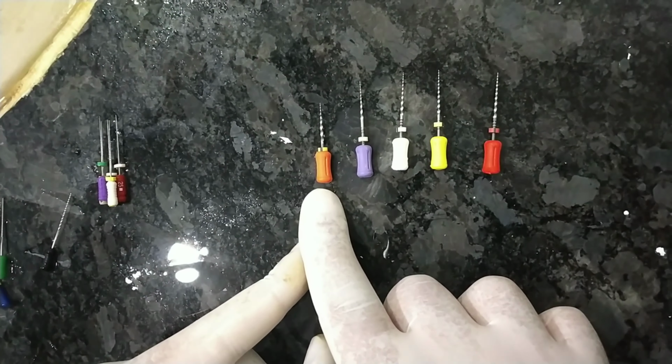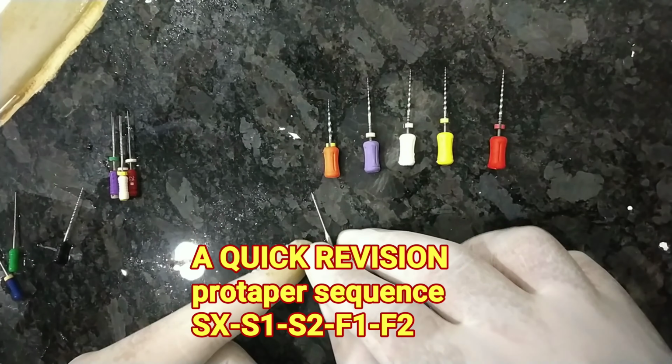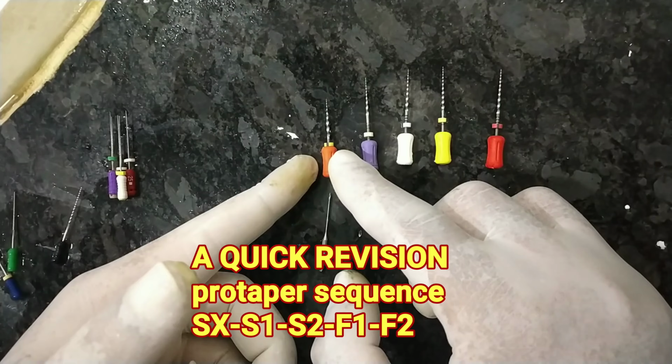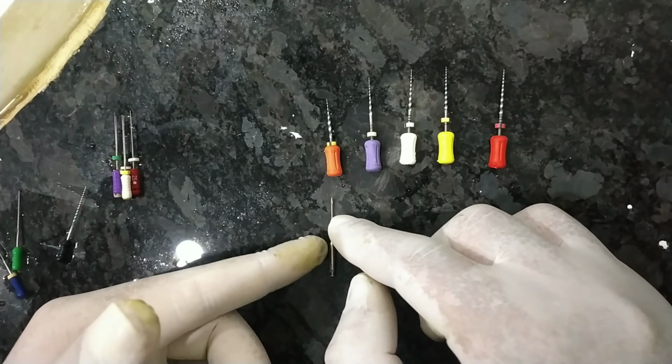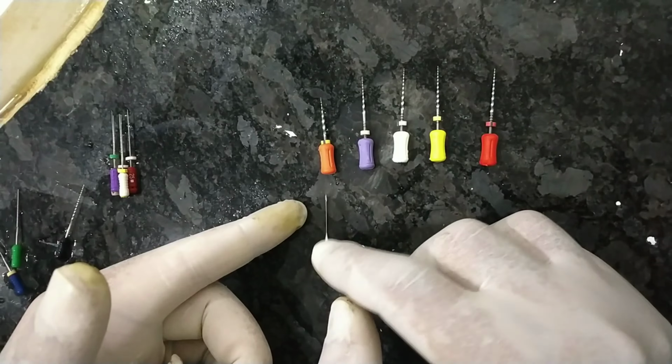The first is the coronal flaring file or the SX files. Instead of it, we can also use the Gates Glidden drill. This one you can use in only 5 to 6 canals. This one you can use in many canals, around 15 to 20, but you make sure you autoclave them.